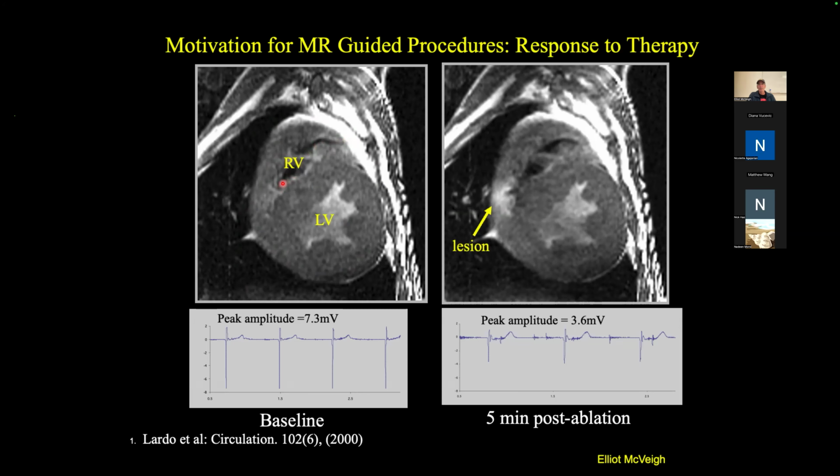In there, we have put an electrode, actually, and the electrode is measuring the myocardial voltage, the peak amplitude here, which is 7.3 millivolts. And so you can go point by point in the myocardium and see the depolarization locally, like the size of the darn electrode, right?